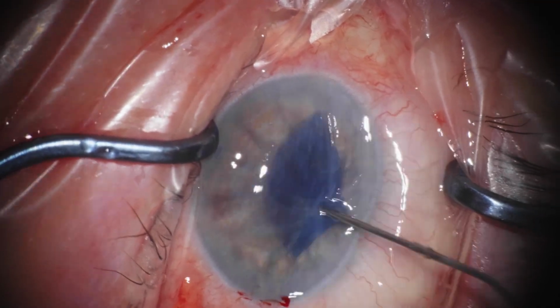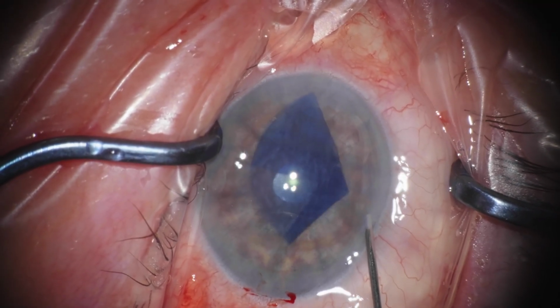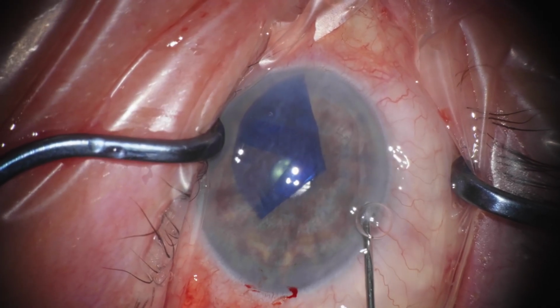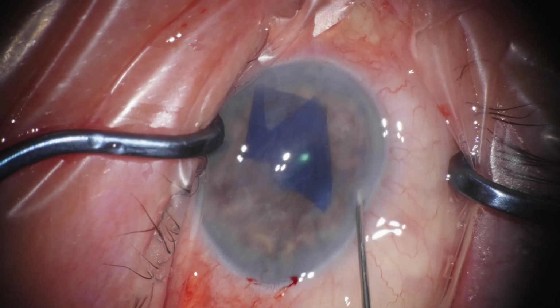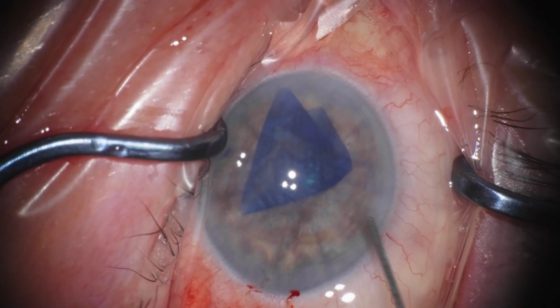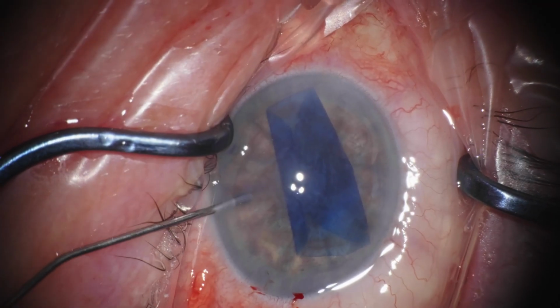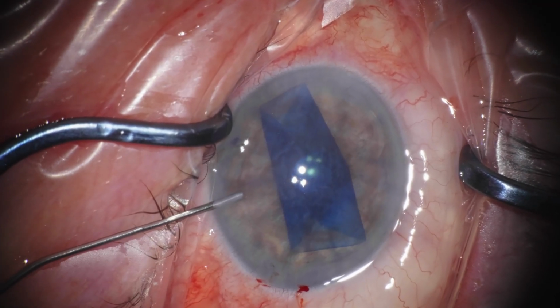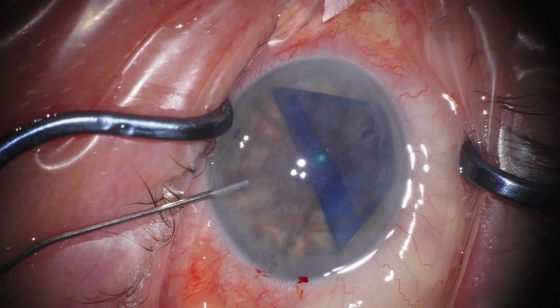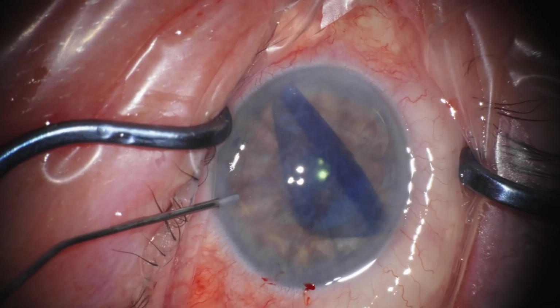This usually happens with the retrobulbar block, which we always use for these cases. We're considering changing this type of anesthesia, mainly because this is the only real thing that can happen during DMEK, aside from fibrin, that can really mess up your whole surgery. So having posterior pressure and the inability to deepen the chamber will lead to almost any graft size being too big for that particular AC.